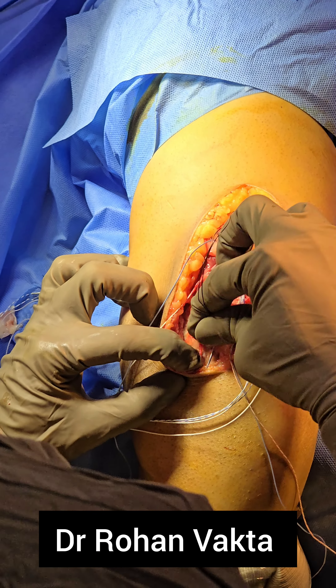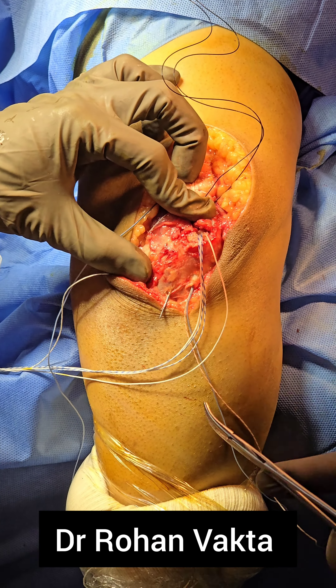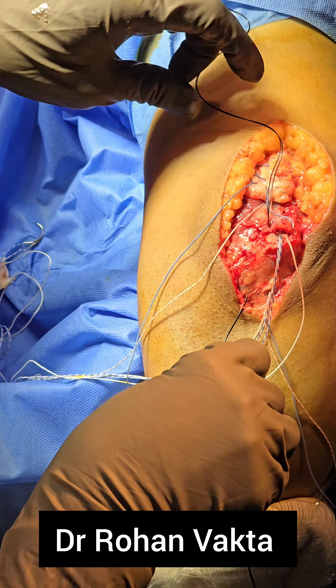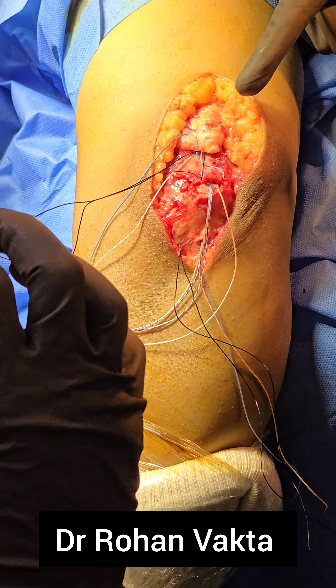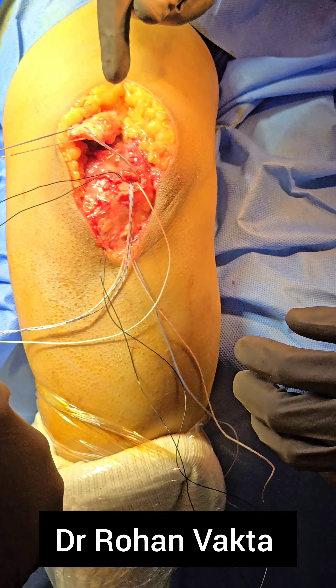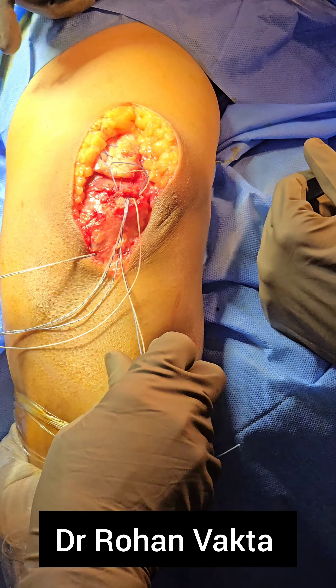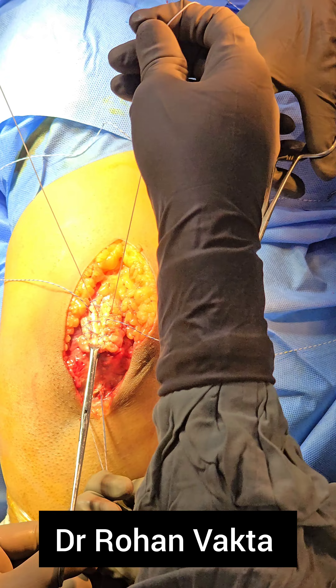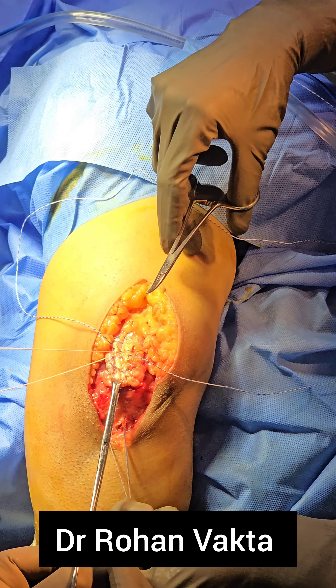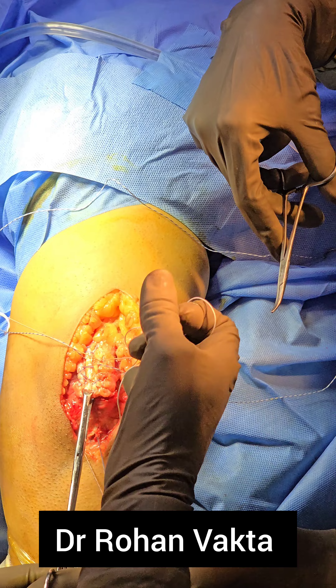It is very advantageous to have a straight needle with an attached ethylon loop for this technique. Through that small 2 mm tunnel you can shuttle both fiber wires one by one, as you can see in this video. This hole will also act as a bone-stimulating factor to increase the healing potential of the triceps tendon, as a bone marrow stimulating substance will come out through those holes.